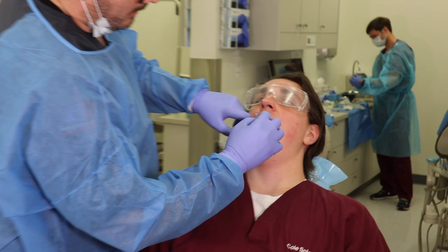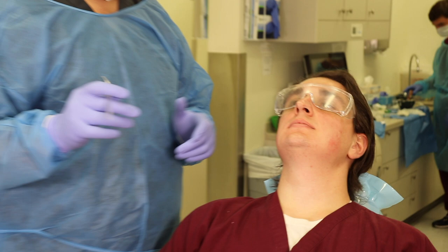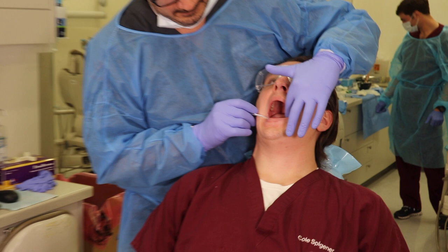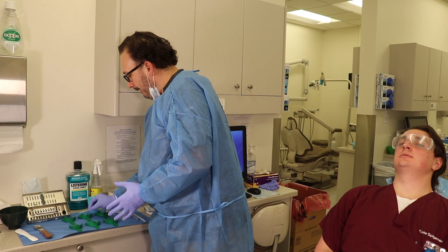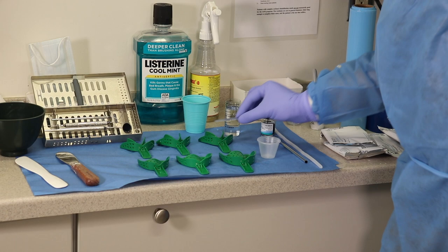Once we thoroughly check for any of those problems, the only thing I need is a disposable mirror, or just a mirror. I also want an easy way to measure or give me an idea of what size of tray I'm using. I will use the back end of the mirror, take it maybe to the first molar area, and from there I can get a very rough measure. Then I can go on my trays and place one where it might go, at the first molars. In this case, for example, I probably will be going for a large plastic tray.